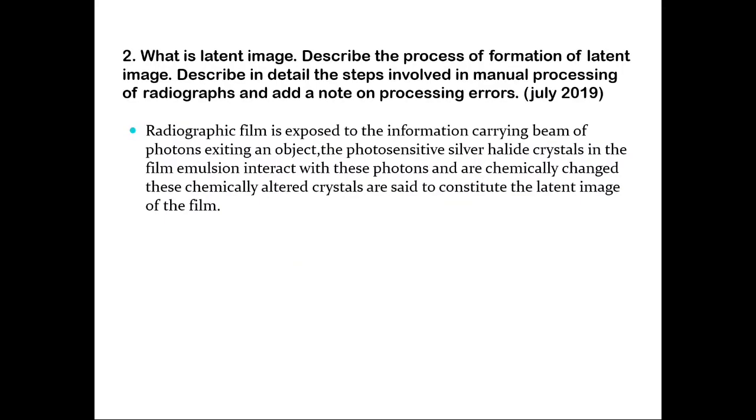The next sub question is to describe in detail the steps involved in manual processing of the radiographs. You can refer again from White and Farrow textbook itself. There are around 9 steps that they have mentioned about how the manual processing of the radiographs is carried out.